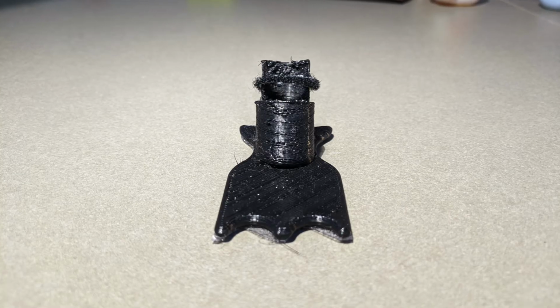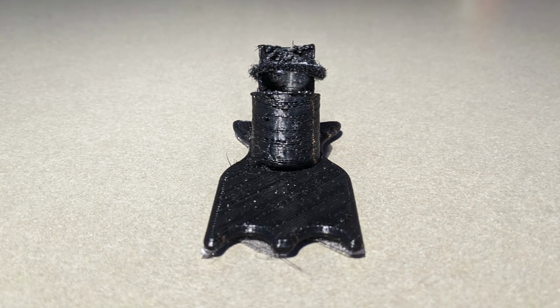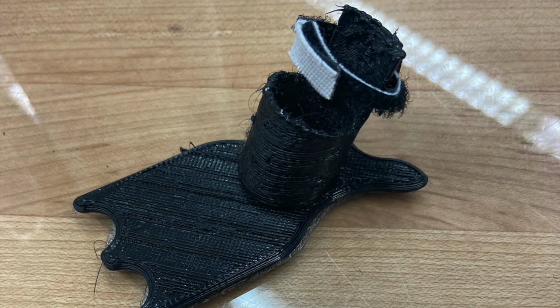We wanted to test this out on Peg now to see if it was comfortable while wearing and that it fit well. When we tested the prosthetic on Peg, we noticed that he had some discomfort where the Velcro was placed. We wanted to alleviate this discomfort, so we took the prosthetic back to the makerspace and adjusted where the Velcro laid in the prosthetic so that we could alleviate that discomfort. Now that the Velcro had been adjusted, we are ready to give the final product to Peg and see if it truly was comfortable and easy for him to use.